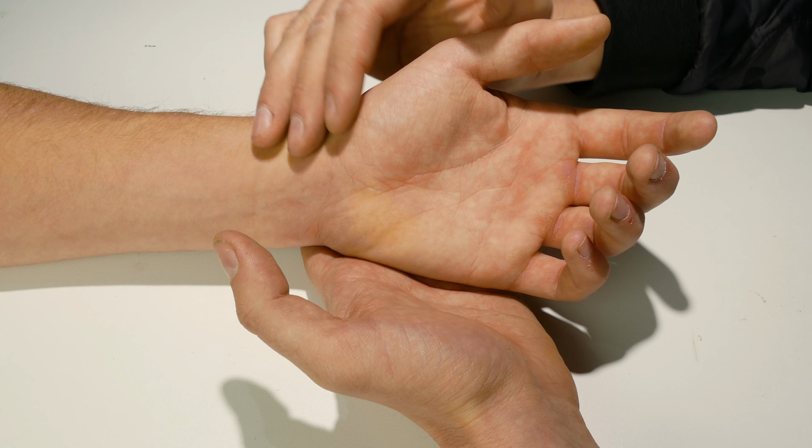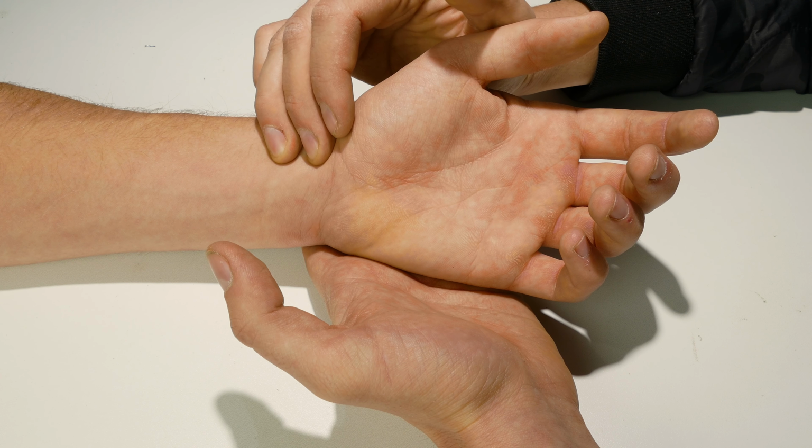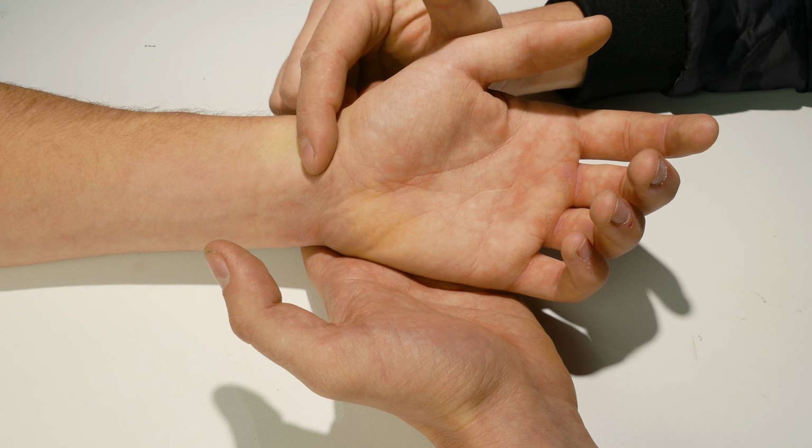Then later, when we're taking a good set of vitals, we're actually going to count that pulse and figure out exactly what that rate is rather than just guessing slow or fast. So when we are assessing for a pulse, we're going to check a radial pulse on most adults, and we'll check a brachial pulse on pediatrics. The reason that we check a brachial pulse on pediatrics is because they don't have as big of arteries as adults, so it's going to be much harder to feel for that pulse on a small wrist of a baby or a pediatric.